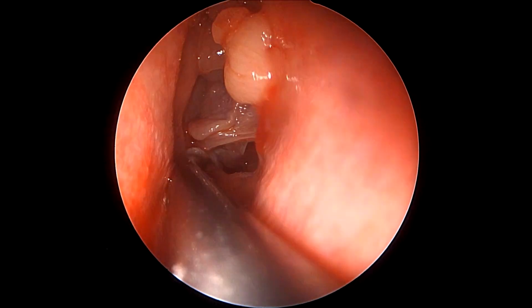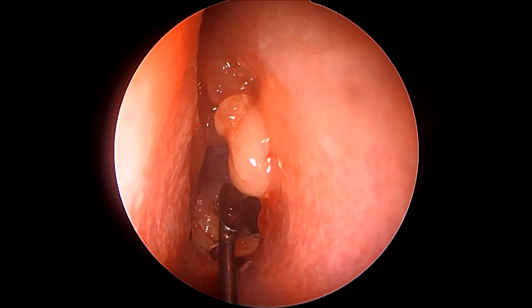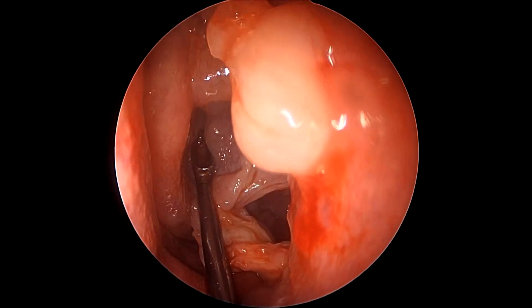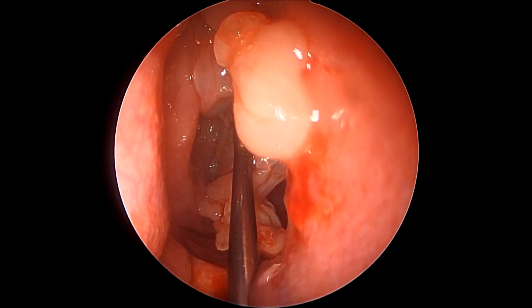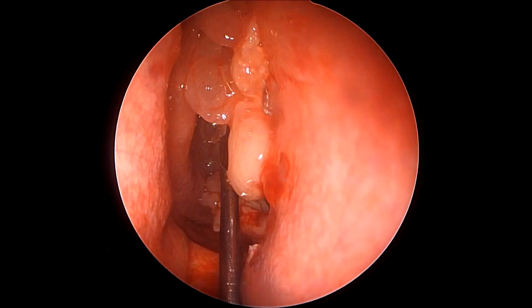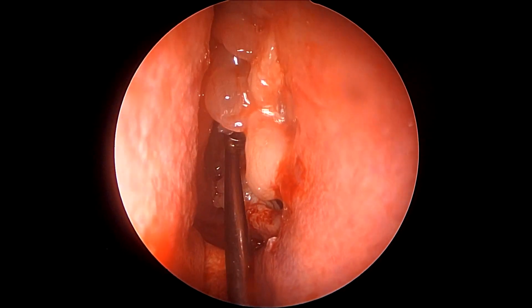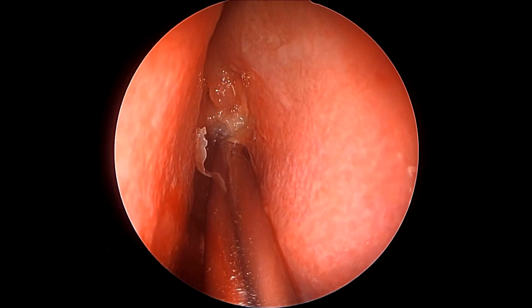So we can see here that the septal spur does cause some impediment to our dissection and overall access to the maxillary antrum. Post the antrostomy, now we are using this frontal sinus curette to back fracture the ethmoidal bulla, which shall later on be consumed with the microdebrider.